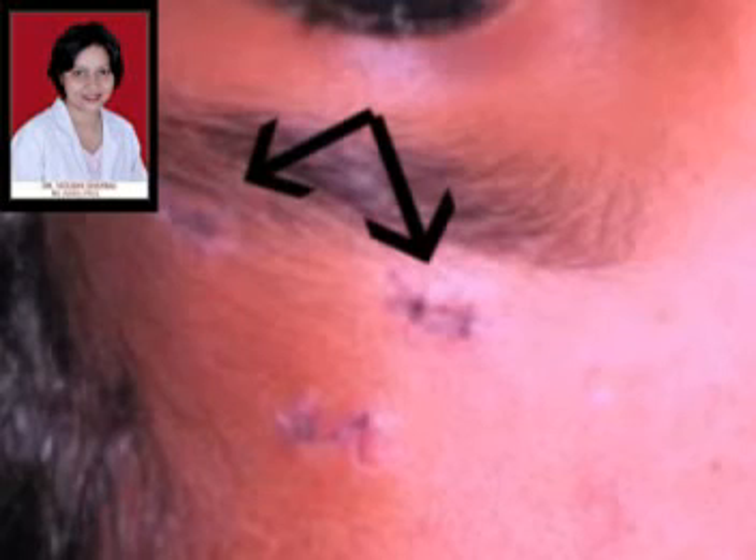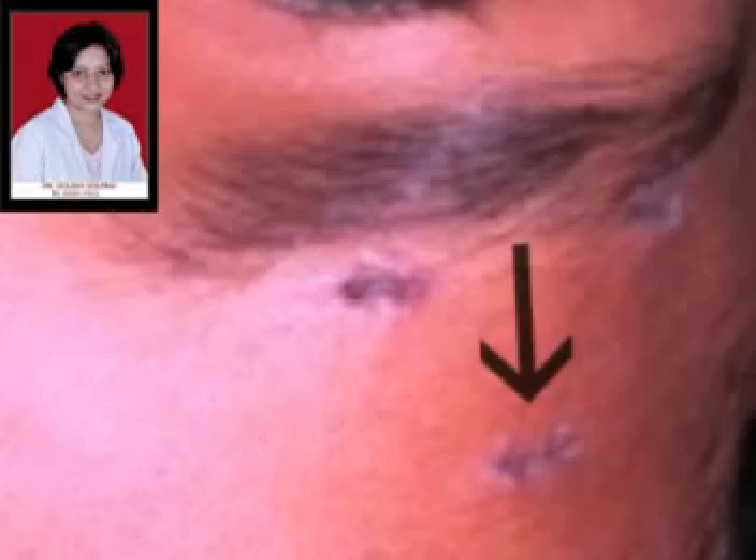Once these lid incisions have been marked, we then mark three incisions above the eyebrow. The two medial and lateral incisions are just above or just wider apart compared to the equivalent medial and lateral incisions in the eyelid, and the final suprabrow incision is about 1 cm above the brow.